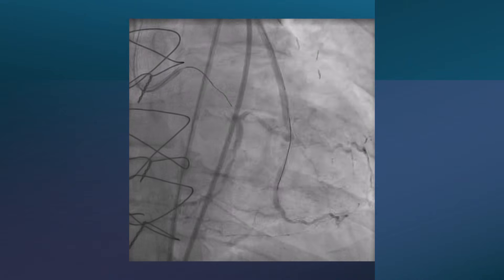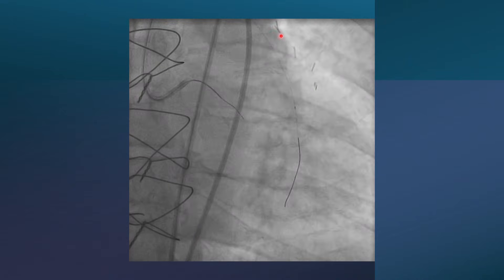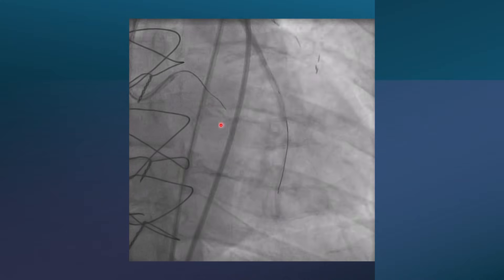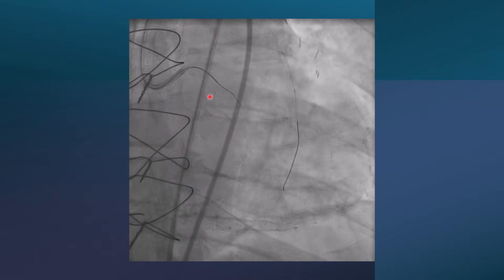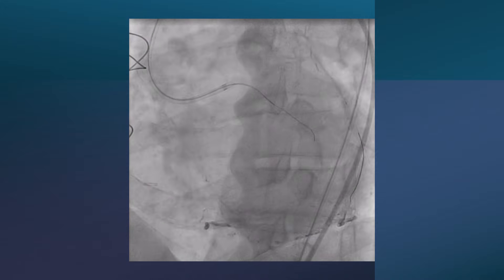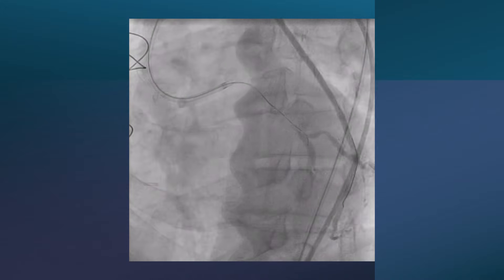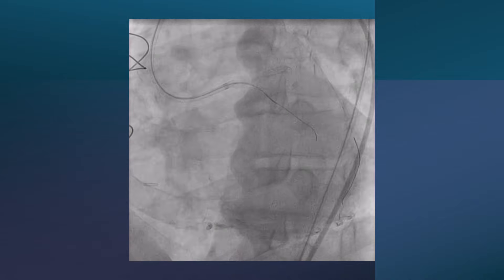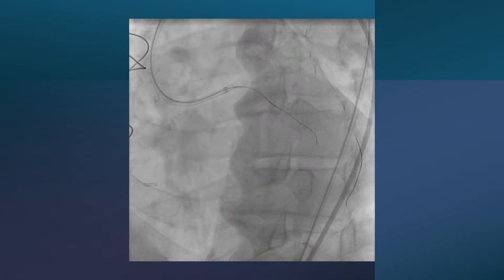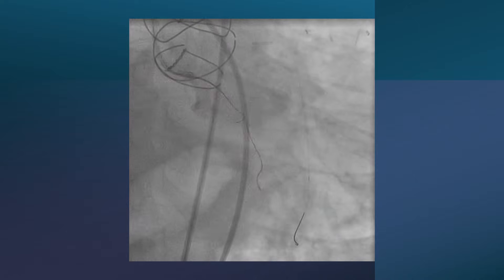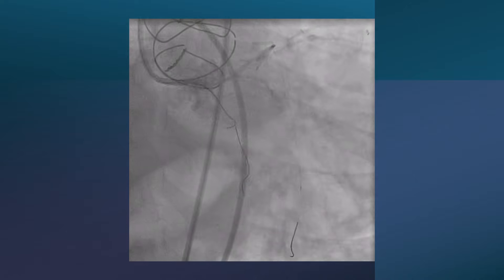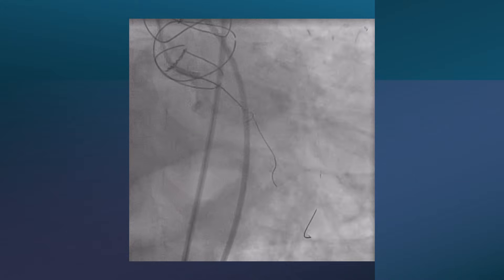We used a bilateral approach with a catheter in the SVG as a safety wire and a microcatheter with wires into the circumflex. Multiple wires attempting to open the CTO with the antegrade approach failed — the wires were consistently going extraluminal. The parallel wire technique also failed.